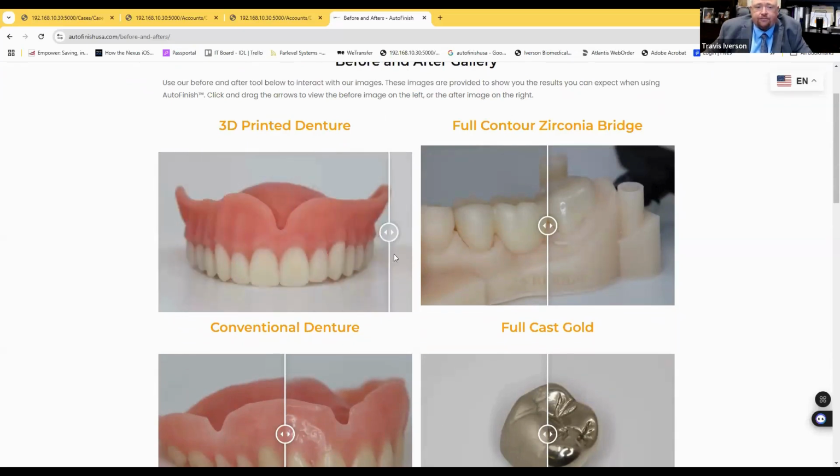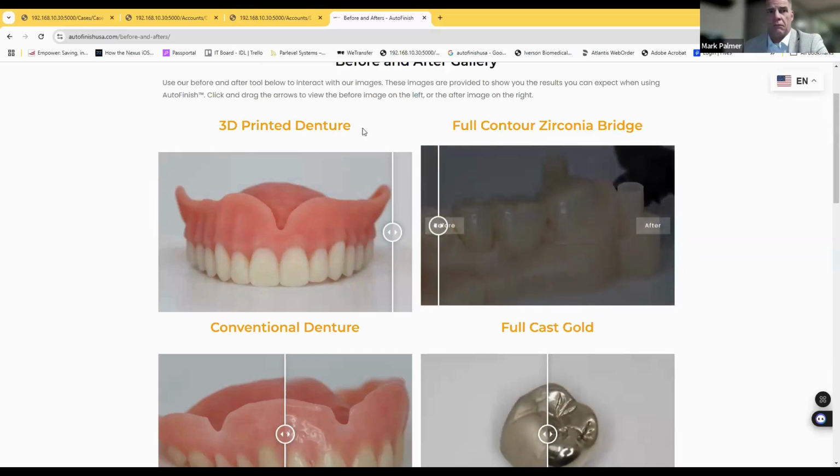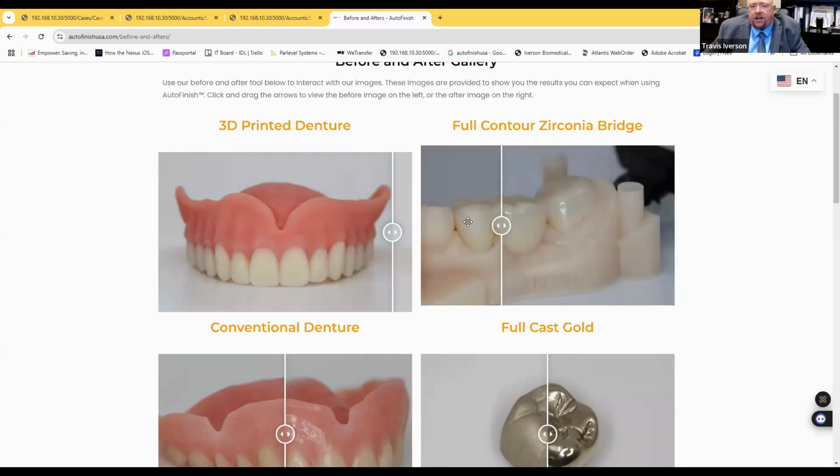which is amazing. Going back to this, what we love about auto finishing zirconia is that when you're doing model free, we had doctors complain about pooling glaze in the contact areas and having higher seat times. So what this does, when you auto finish the zirconia and take it to this high shine, as you can see, remember, there's no glaze on here. That is an auto finish surface. Pooling glaze in the contacts is going to cause seating issues or even occlusion issues.